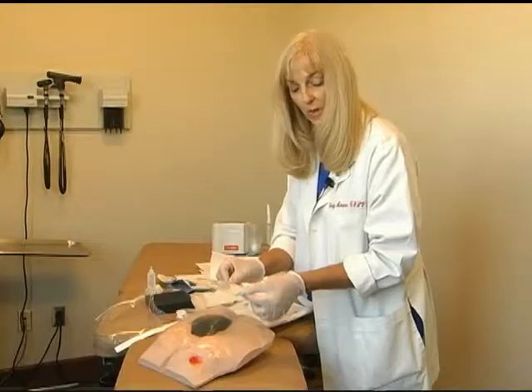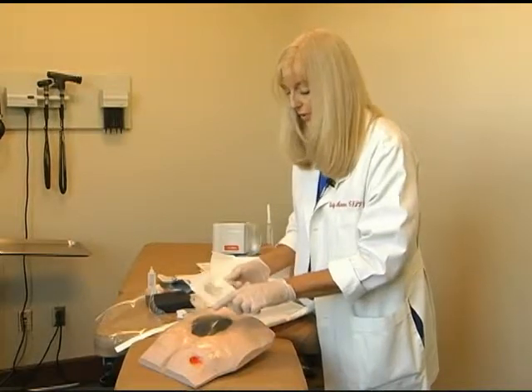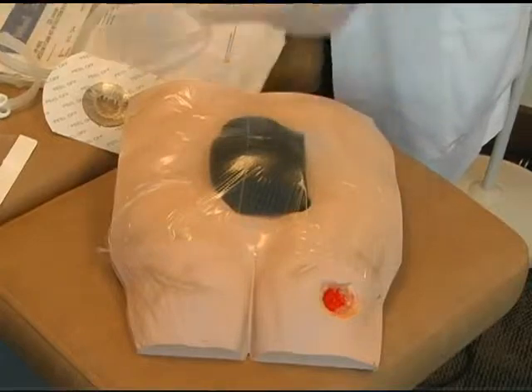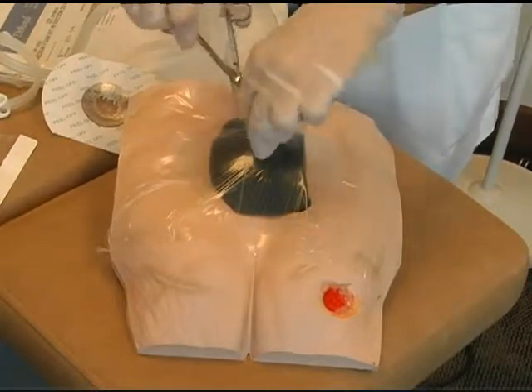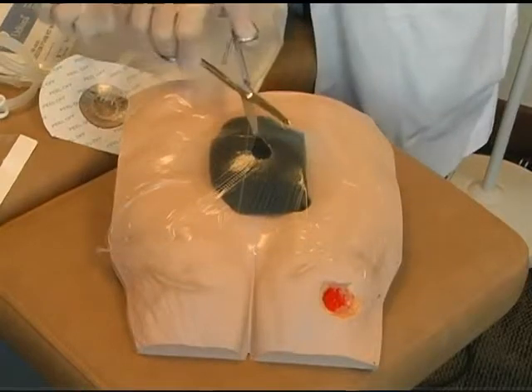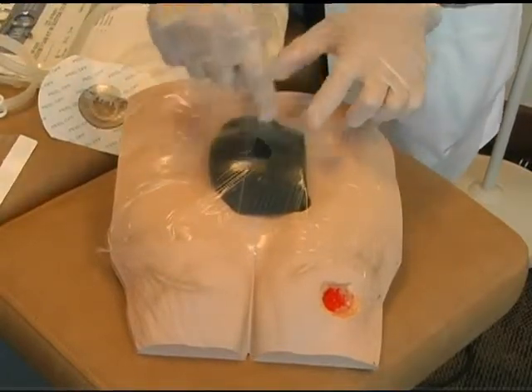Applying the dome goes directly over the wound filler. We have to create a space for the vacuum — or for the air to be removed from. By lifting and simply cutting, you have created an open area into the wound filler.